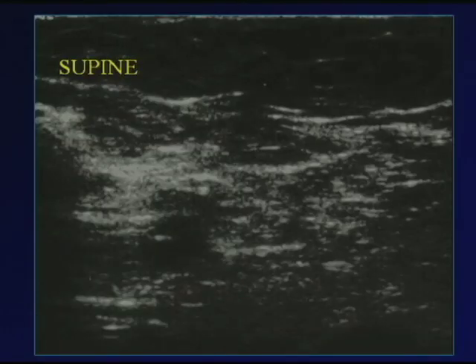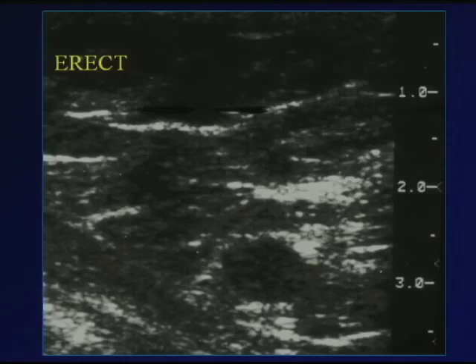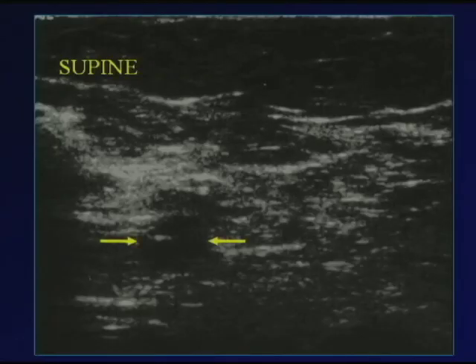And initially we tried very hard to find the mass on ultrasound, but it was surrounded by a lot of fatty tissue, and it was nearly isoechoic to the surrounding tissue, so it was very difficult to see. We sat her up, and although it's still difficult, we were able to find the mass, and then we could follow the mass back into a supine position and find it, and able to perform a biopsy once we found it.